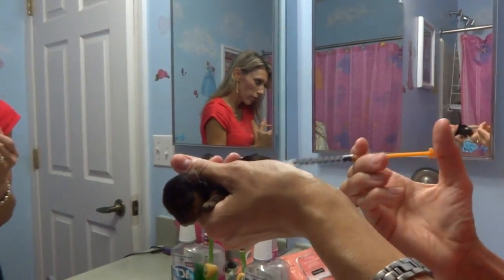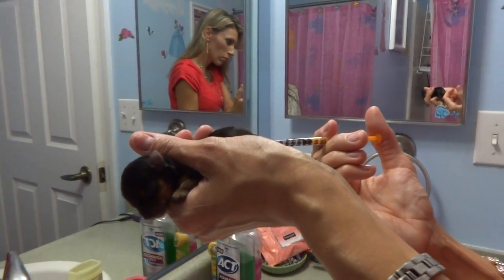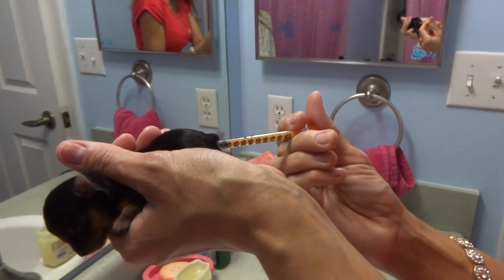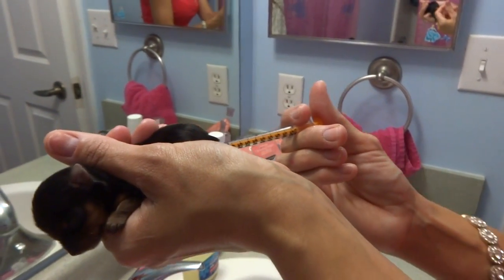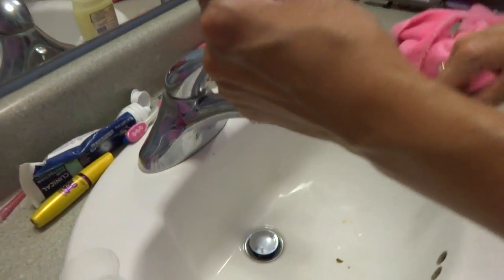It's already starting to go. Hold it there for a second so she doesn't shoot it right back out. There we go — can you see those little hard little turds coming out?